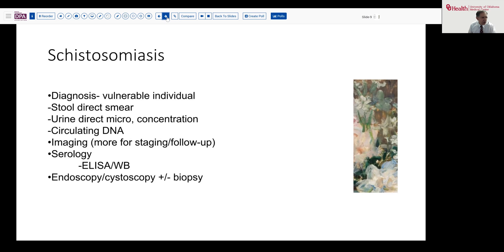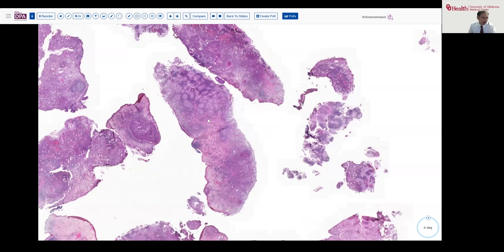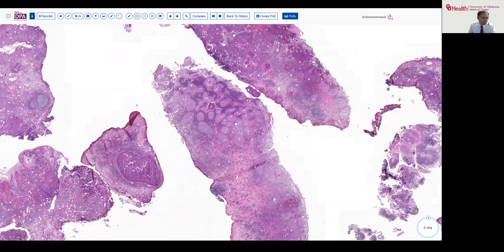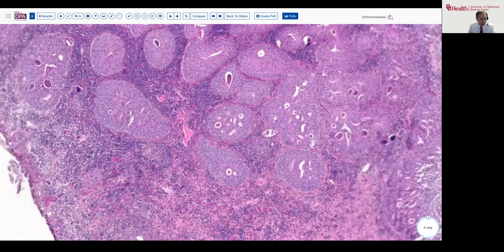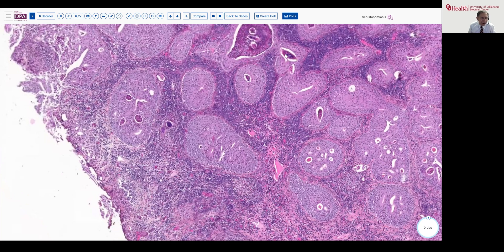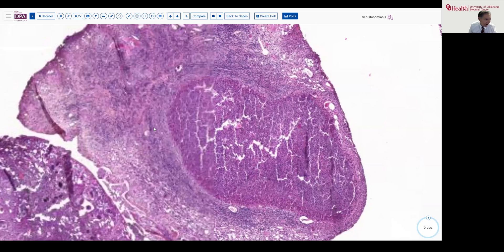In terms of the schistosomal organisms, they can be present either in the egg form we saw in the tube, or you can find evidence — particularly in areas they tend to inhabit — of a direct inflammatory response or even an epithelial response to the actual worm itself. We've got several little foci of rounded areas that can be associated with a lot of inflammation. This is more the size of some of the eggs, but we also have these larger micro-abscess changes — this is from bladder mucosa. As you pan around, you see evidence of the actual worm itself in some of these areas.